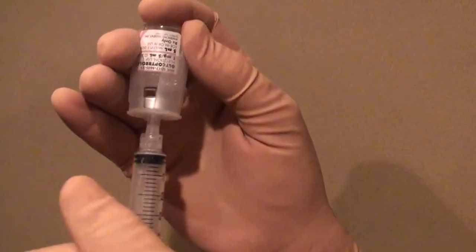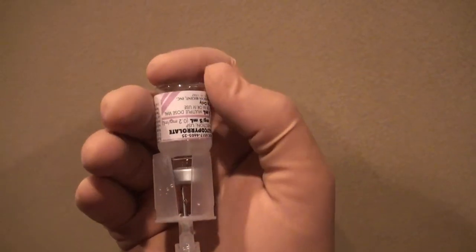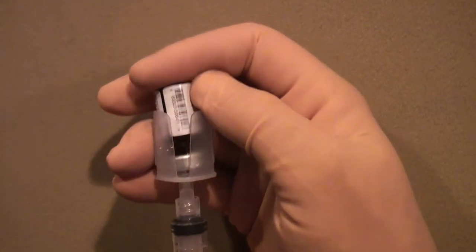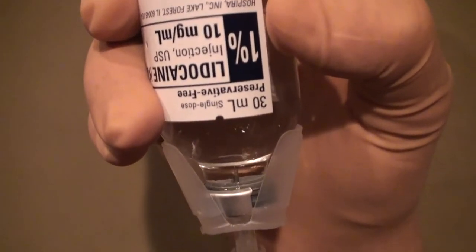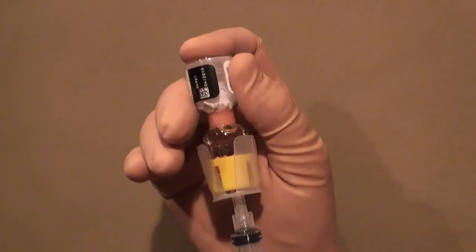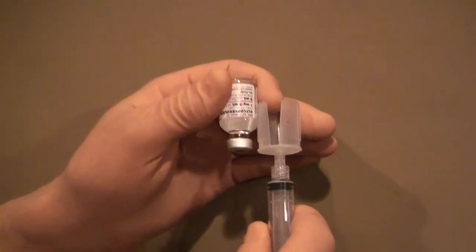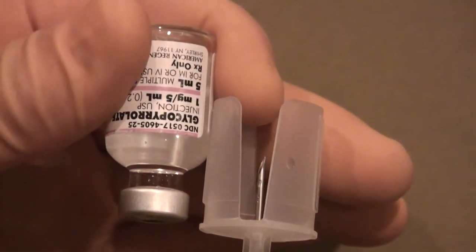Medication vials effortlessly seat onto the MedMate for quick and easy withdrawal of the drug. Vials of every size and shape click onto the MedMate, allowing for easy withdrawal of medications. MedMate's protective flanges flex to allow withdrawal from vials of odd shapes and sizes. Slow motion photography demonstrates what would have otherwise been a needle stick with a regular needle, but MedMate's needle guard protects the finger by keeping it away from the needle.